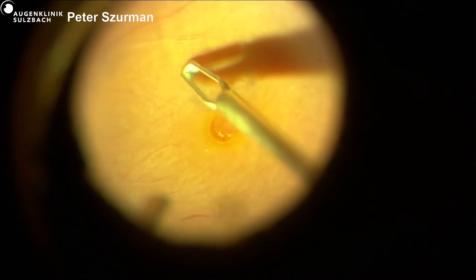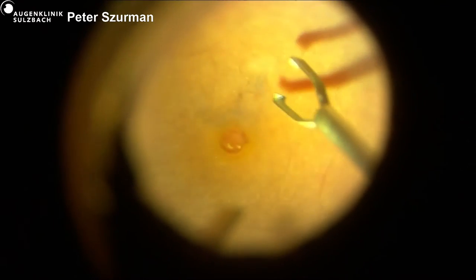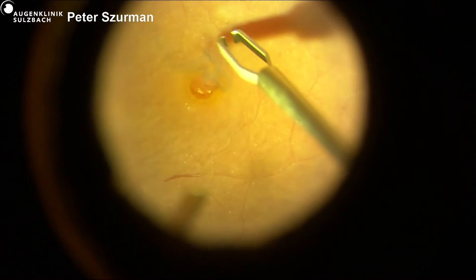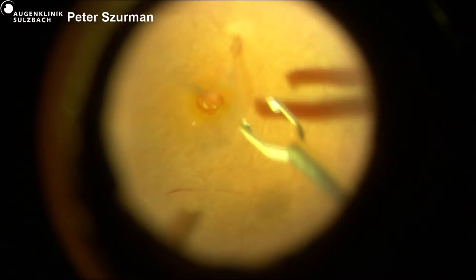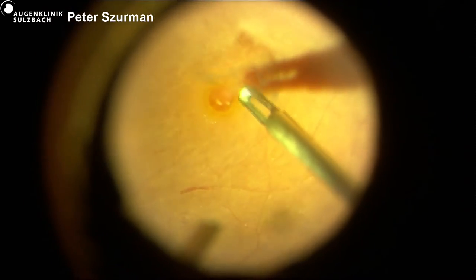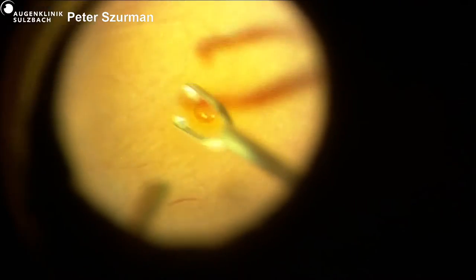Yes. Are you performing all the surgery with a contact lens? Yes. My plan is yes. At the end, we control the peripheral retina with indentation, but the plan is to perform all the vitrectomy with the contact lens. You have more retinal details, more vitreous details. I am using 10% of light with Artevo. You can save more phototoxicity a lot with this microscope.